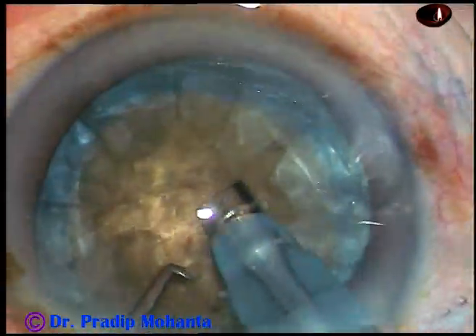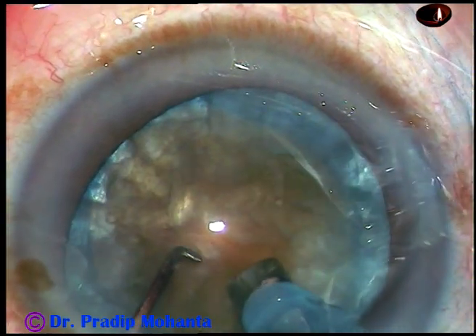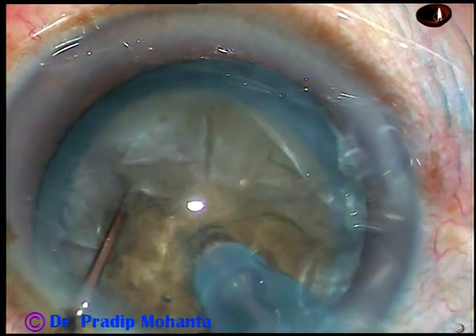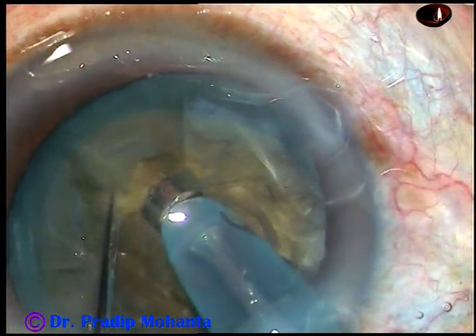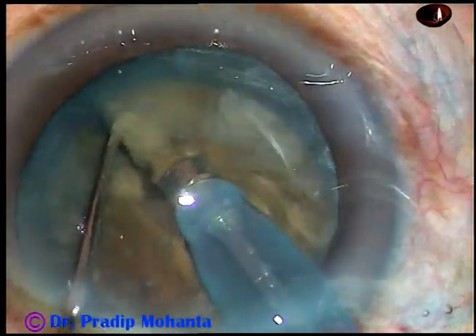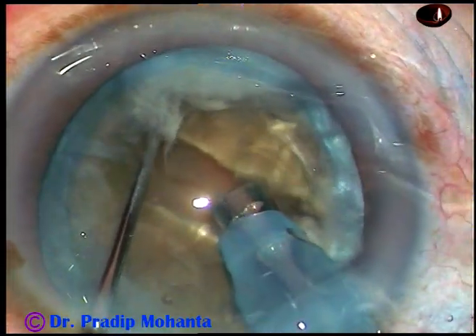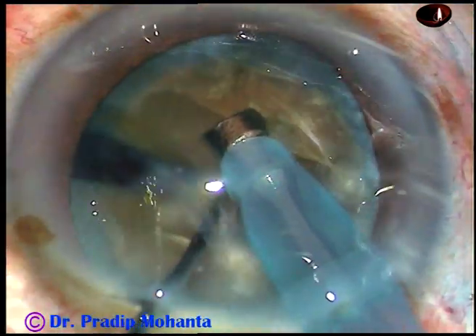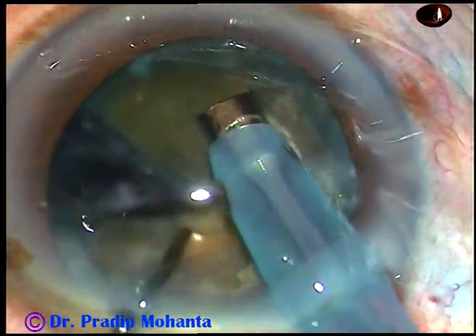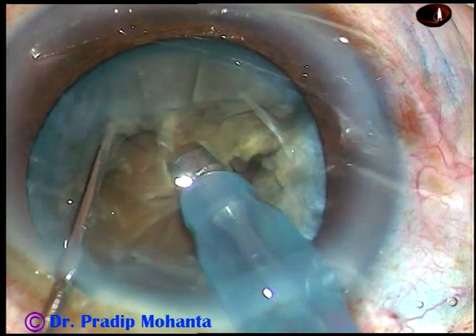Here it is. Push the nucleus a little down, bury the tip as much as possible, go through the substance of the nucleus towards the opposite equator and chop. So, this is direct horizontal chop — I call it submarine chop. But in this case, there was a leathery band connecting these two hemi-nuclei.